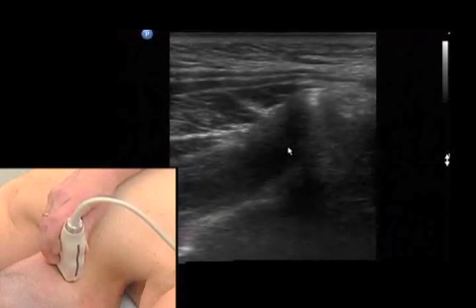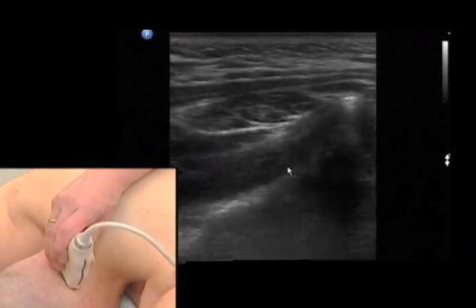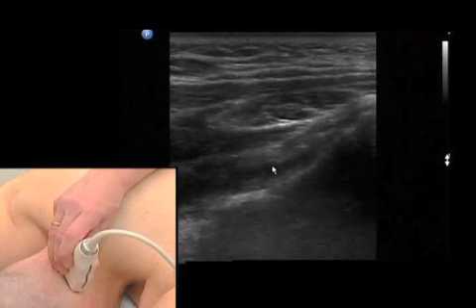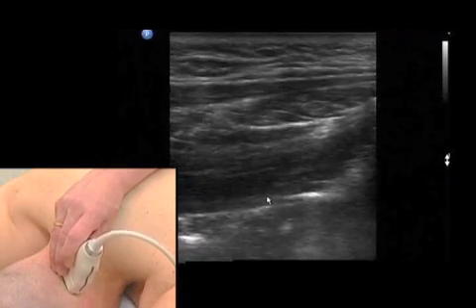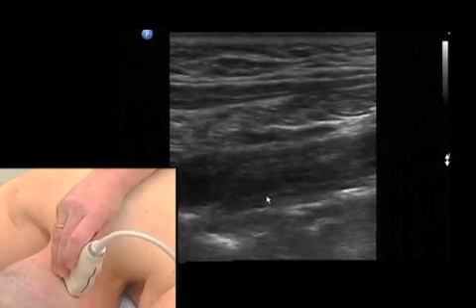Moving very slowly to image our key muscle — explained in the anatomy part — which is the inferior oblique muscle, or obliquus capitis inferior muscle. This muscle is very, very thick, and this is more or less what protects us from doing any harm to deeper structures.